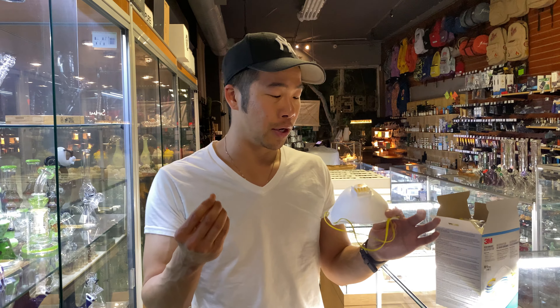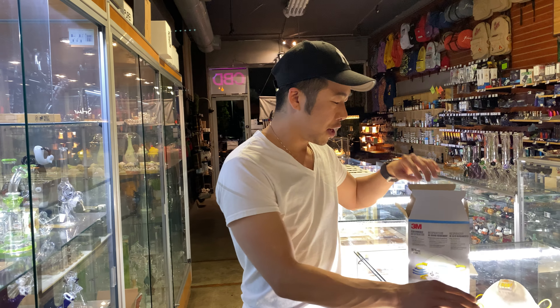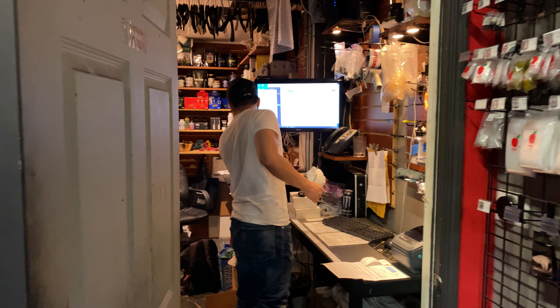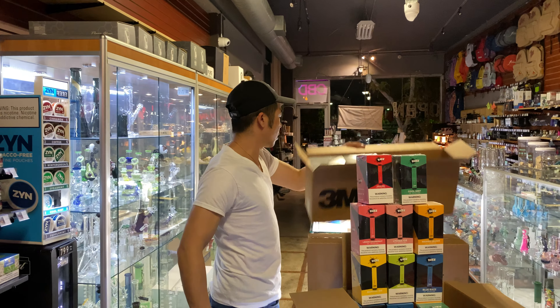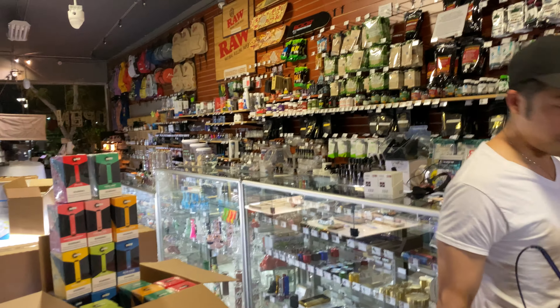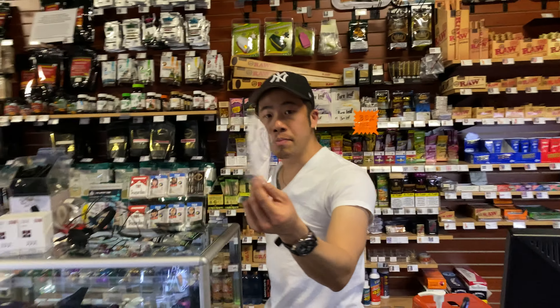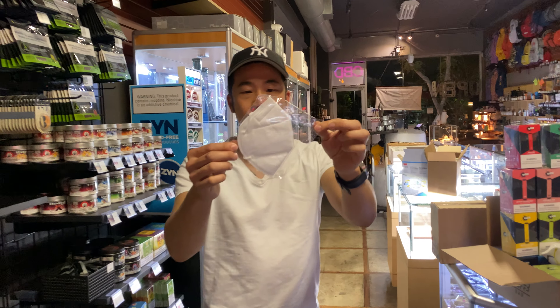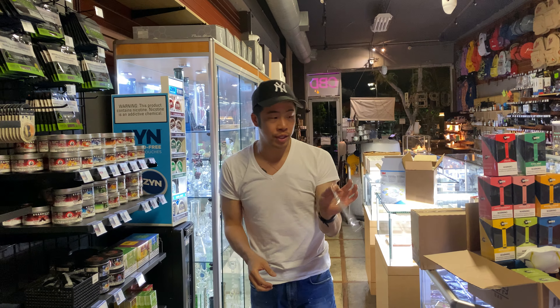Another value tip I'm going to throw in: if you're using these masks — I'll show you some more masks we have here. We have several different types of masks depending on which one you've got. So let's say you got these masks — these are different N95 masks. If you bought any of these masks, this is what I would do with them.